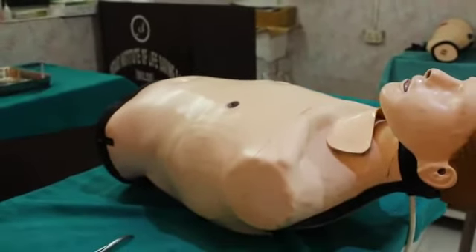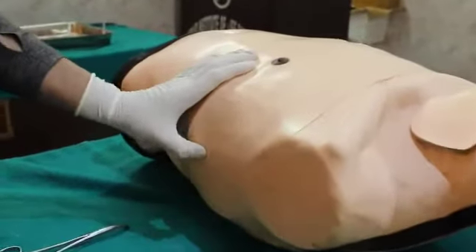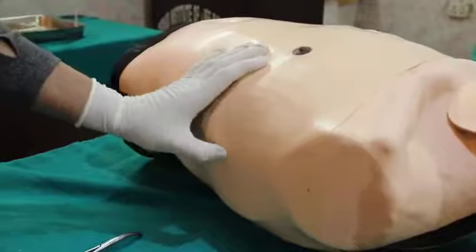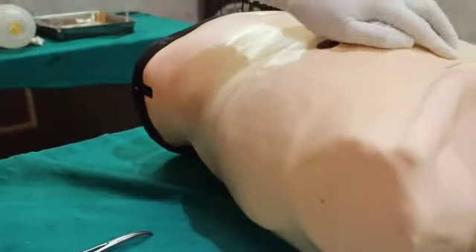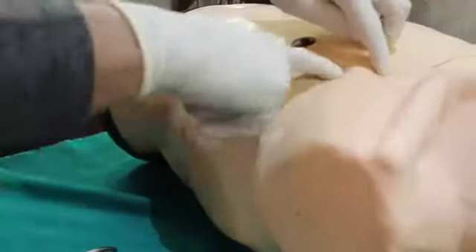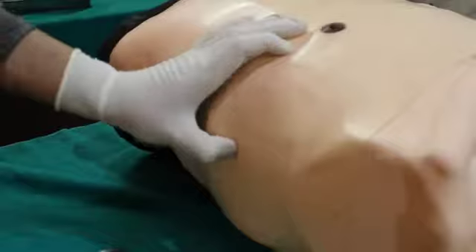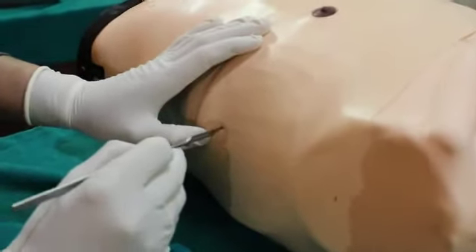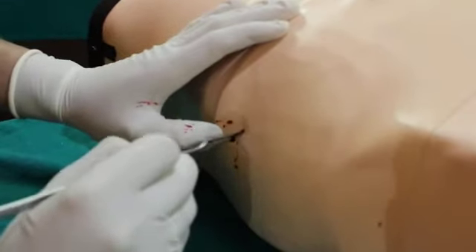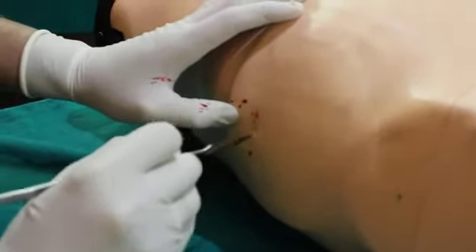Now I will show the procedure. I have given two spaces in this mannequin — the fourth and the fifth intercostal space. I will be using the fifth intercostal space. We count ribs from the sternal angle. So this is the second, this is the third, fourth and the fifth. Just anterior to the mid-axillary line, upper border of the lower rib — give approximately one centimeter long incision, cutting the skin and subcutaneous tissue.